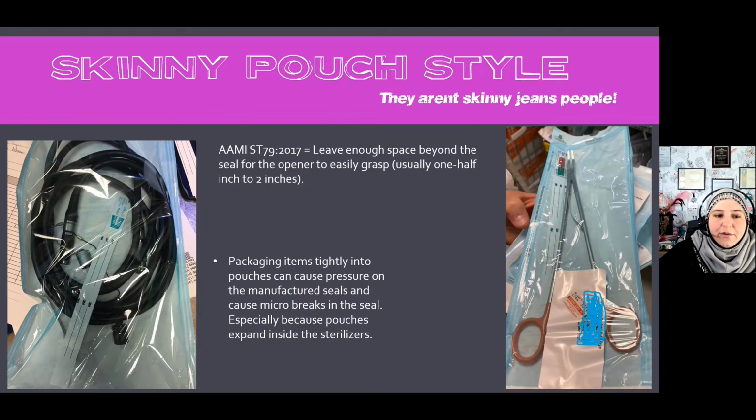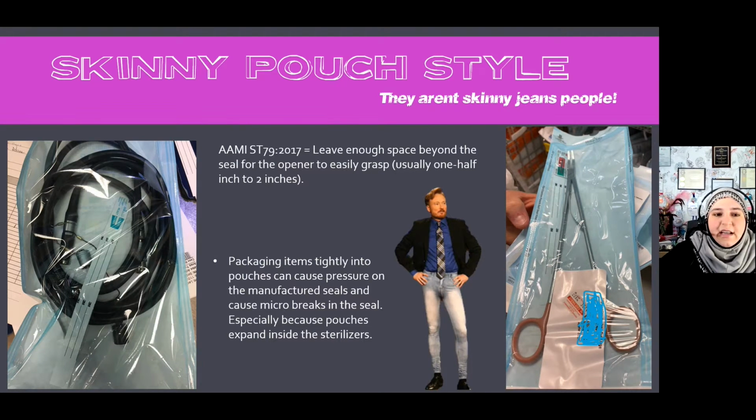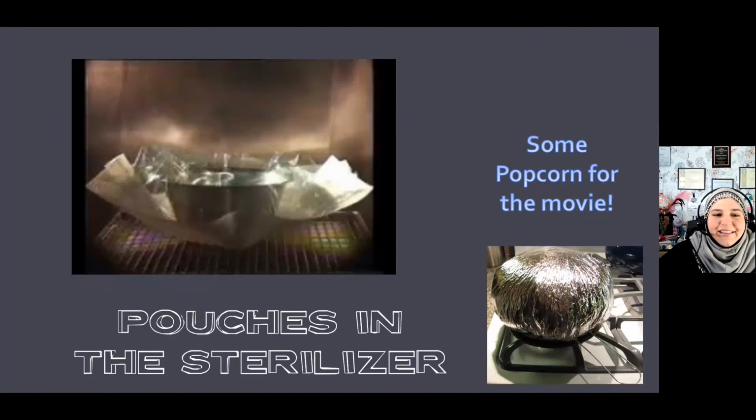And if your packaging is tight like this, what winds up happening is when it goes into the sterilizer, it expands and contracts, right? And as it does that, you're already putting a lot of stress on those manufactured seals. And those seals can start breaking and getting micro holes in them and not be able to keep the sterility barrier that it needs to. So there's Conan and his skinny jeans for you.